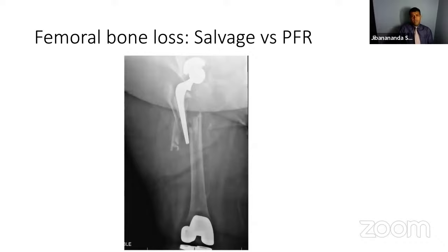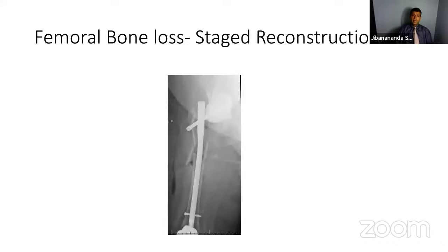Another patient of mine was referred to me for a periprosthetic fracture with a loose acetabulum and a loose femur. This is a lady who was really short, about 4'6" or 4'7". This was a tough situation. She had a loose implant for a while, and she was aware of that. But with this fracture, we decided to salvage it.